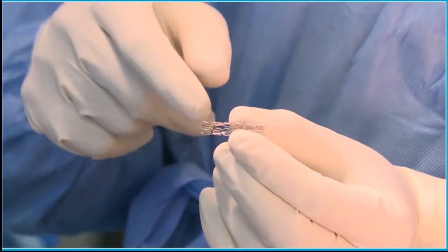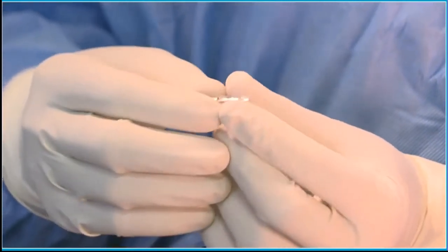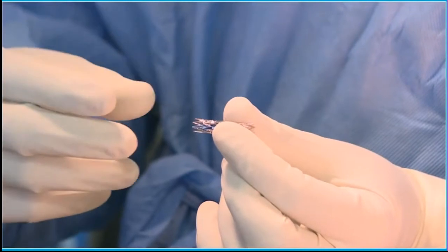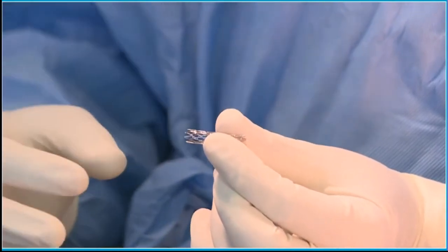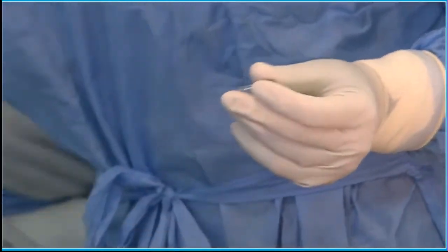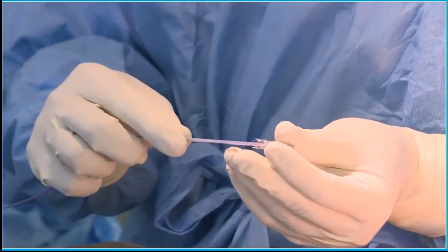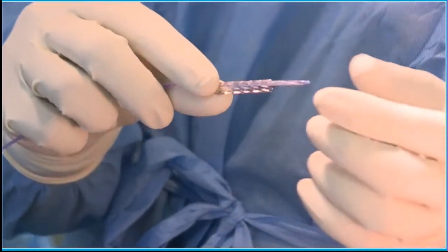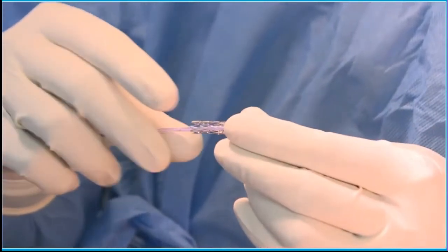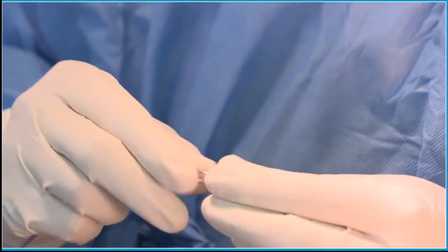So this particular stent does not allow any foreshortening at all. And this is a stent with a radial strength which is comparable to Andra XL stent. So the radial strength is quite good. So our plan is to take it on a 12 millimeter balloon. So this is a 12 millimeter Admiral Xtreme. So I'm going to be mounting this stent onto the Admiral Xtreme. Sister, connect it to the syringe. So I'm gently crimping.